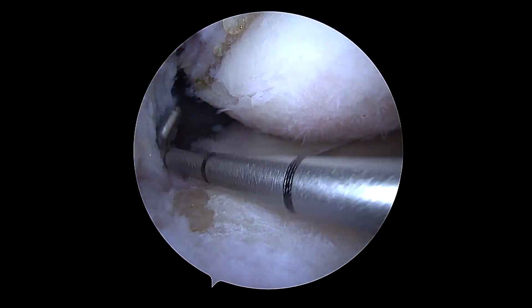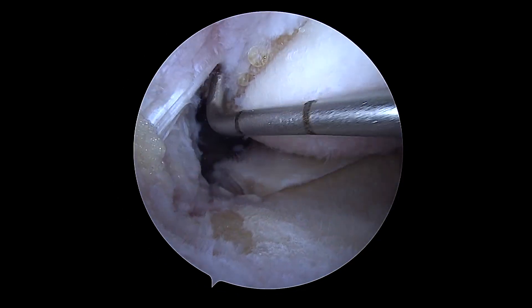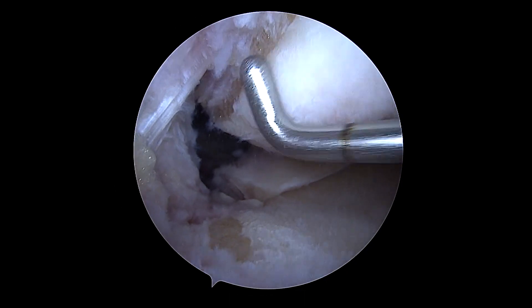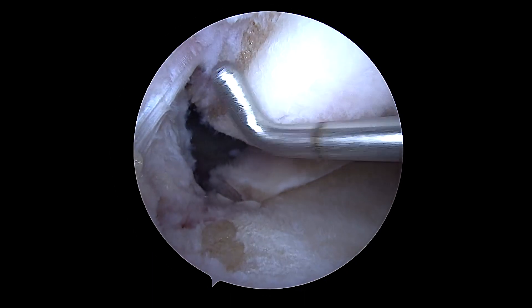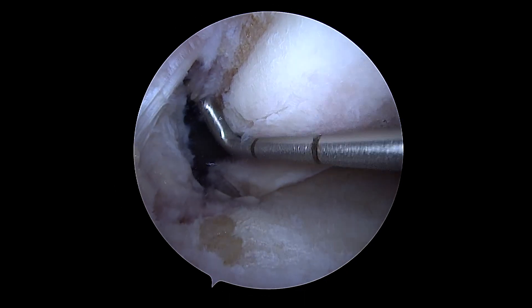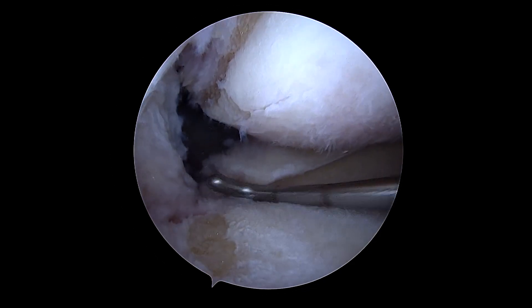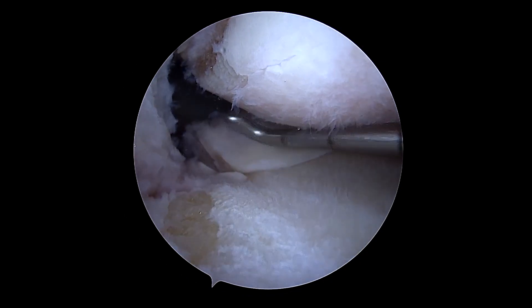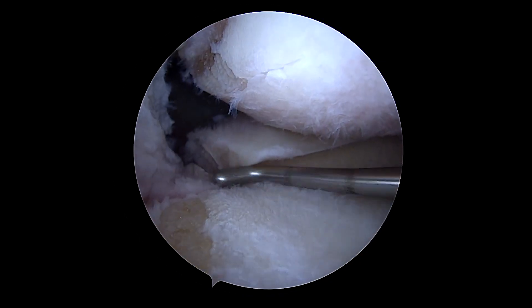We've removed a little bit of the PCL synovium and then performed just a little bit of reverse notchplasty. This isn't often necessary with the Arthrex tools we're using for this case, but something to keep in mind if you have an osteophyte or tight space. All of these measures really give you a nice view and allow us to safely perform our work.